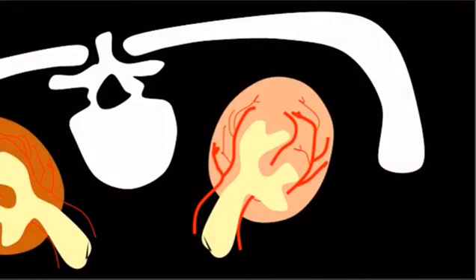The next thing, and I changed the color of the kidney to make the vessels easier to see, is you want to pick an entry site that's around 30 to 45 degrees. You want to hit a peripheral posterior calyx. The reason you do these things is this idea of a bloodless line. Notice how the vessels here are on one side and then on the other, and right through here is this quote-unquote avascular line. It's not truly avascular, but it's less bloody than it would be if you went through here.